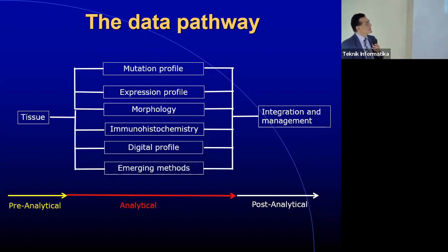And then we had all these other things come along. So now we need to also look at the molecular profiles, the mutations, the genes which are being expressed. There are new methods coming along all the time. We're now also looking at the digital profile. All of these things we need to get together to then pass on to clinicians. But now you can see that whereas before we were going home at 10 o'clock, now we just don't go home. We're doing all of this stuff, trying to extract data.